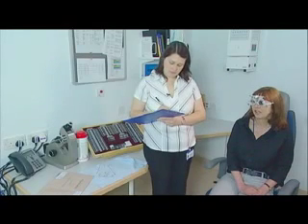At the end of the test, the numbers of circled correct letters are added up and recorded for each row, then summed for that eye at the bottom of the column. If, having carried out the 4-metre test for each eye, the patient is able to read fewer than 20 letters correctly with either eye, then the eye with the reduced acuity is retested at one metre. If testing at one metre was not required, then 30 points are added automatically to the score sheet to give the final score.